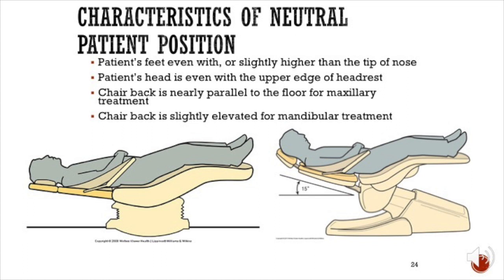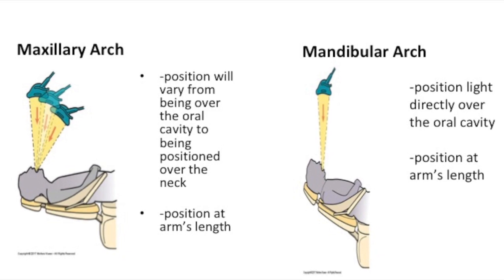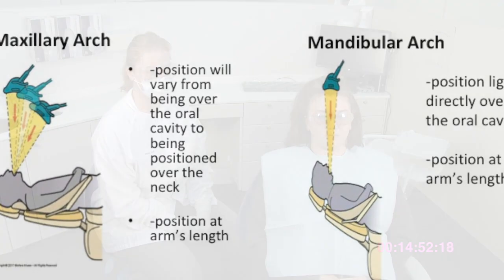The proper positioning of patient care ensures that you have the proper vision to see what you are doing while maintaining a neutral spine, neck, and wrist. Always make sure to have the correct lighting. Let's watch the student and instructor work together before patient care.